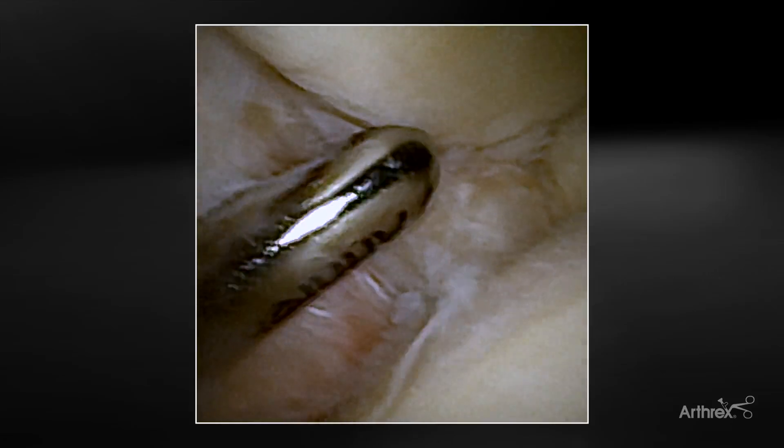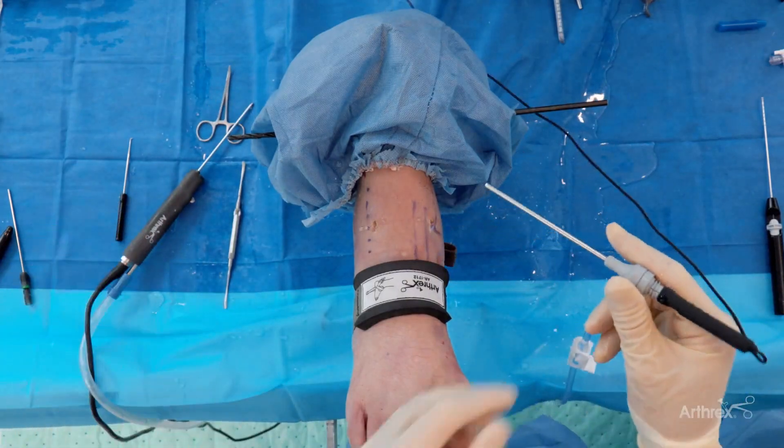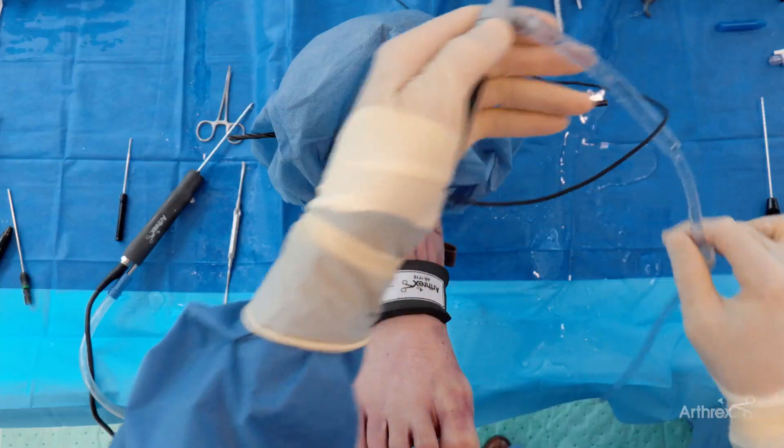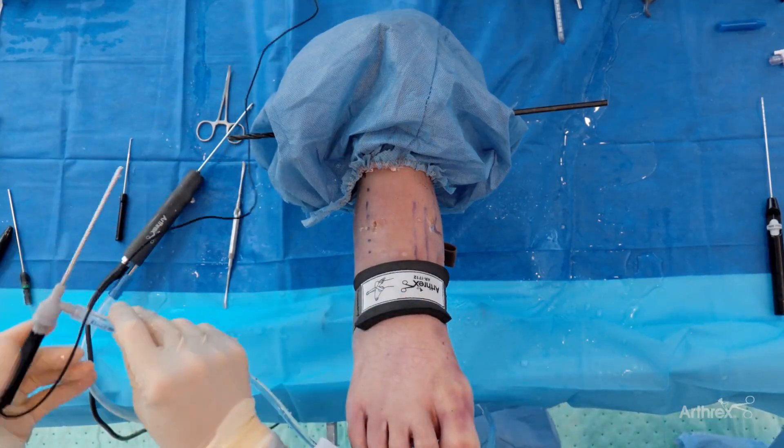I'll also come to the front of the fibula here and just push on it from front to back. You can see that syndesmosis is nice and tight there. If it was unstable, you'd be able to see a little anterior to posterior translation. Just highlighting again the saber shaver — how I can get up into these little tight areas and just kind of clean some of this stuff out. That's the arthroscopy portion of this demonstration. Let me switch the portals and we'll talk a little bit further about something I'm excited about when it comes to ankle stabilization and making decisions on which ligaments need to be repaired.